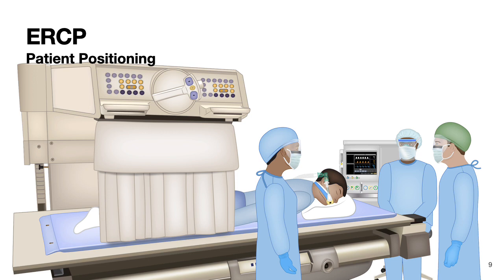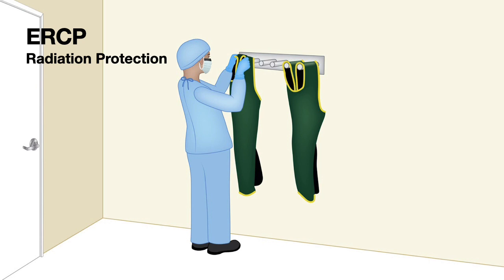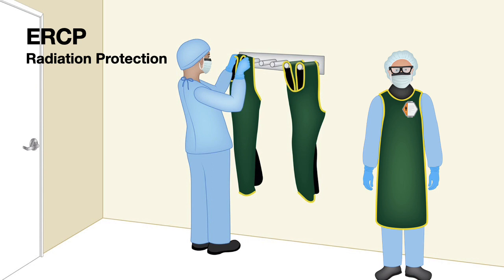So before we do the procedure, everybody should wear the protective gear to protect them from radiation. This involves wearing a lead apron and also lead-lined glasses that protect the eyes, as well as a thyroid shield to protect the thyroid. And on the chest, you see a monitor that monitors the amount of radiation exposure. This is the radiation badge. So as an assistant, before you get into the ERCP room, you should wear a lead apron, thyroid shield, place the radiation badge, and if possible, use special glasses.